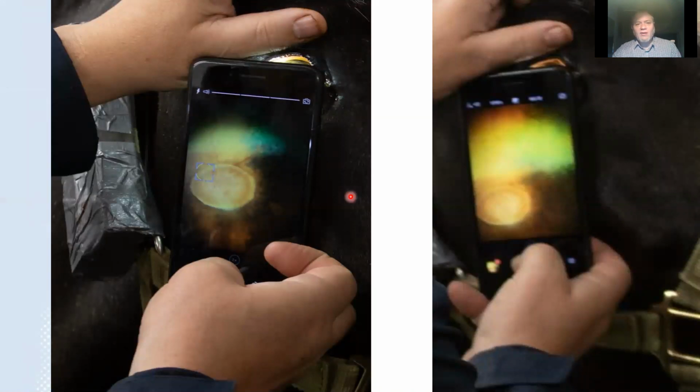When we've got an image of our fundus, then it's not all plain sailing, because we've often got a dark non-tapetal fundus, a hyperreflective or reflective tapetal fundus, and then this intermediate white to pink optic nerve, and each one of those will need exposing in a different way to get the best picture. So tapping to focus and tapping to expose is a useful way of doing that.